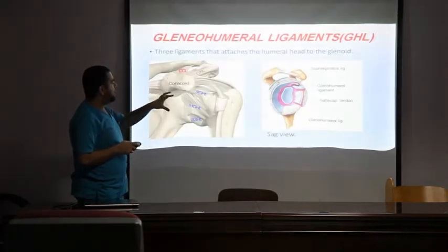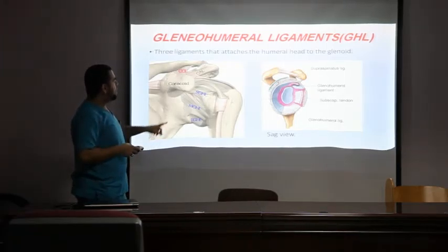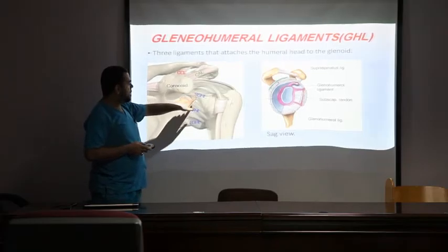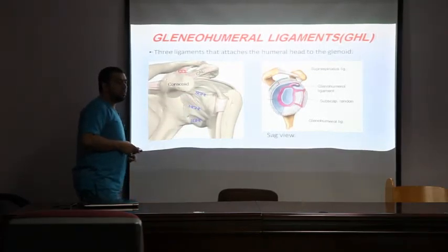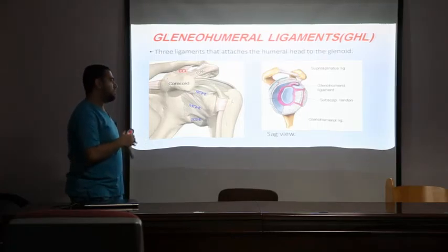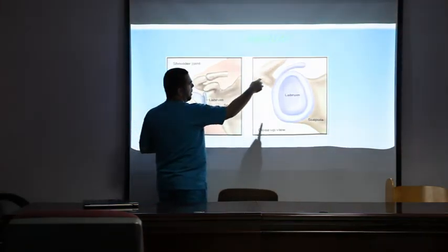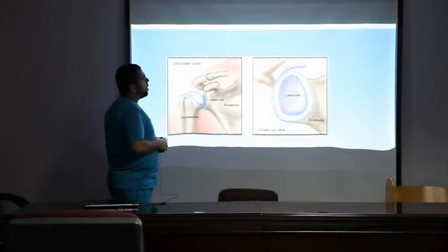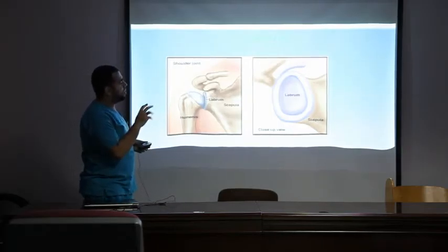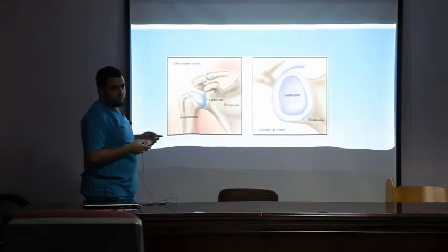The head of the humerus articulates with the scapula via the glenohumeral ligaments — the superior, middle, and inferior glenohumeral ligaments. Any injury to those could lead to subluxation or complete dislocation. The sagittal view shows the labrum, which is a fibrocartilaginous rim that helps stabilize the head of the humerus. Injury to this rim can also lead to dislocation.